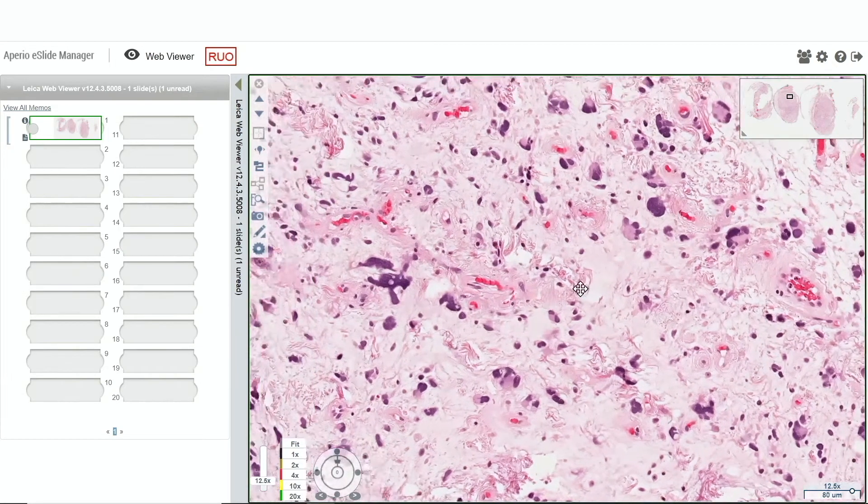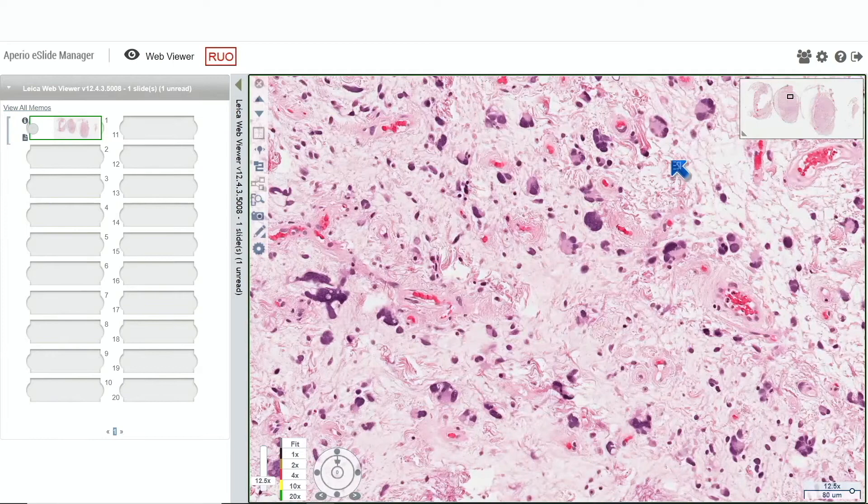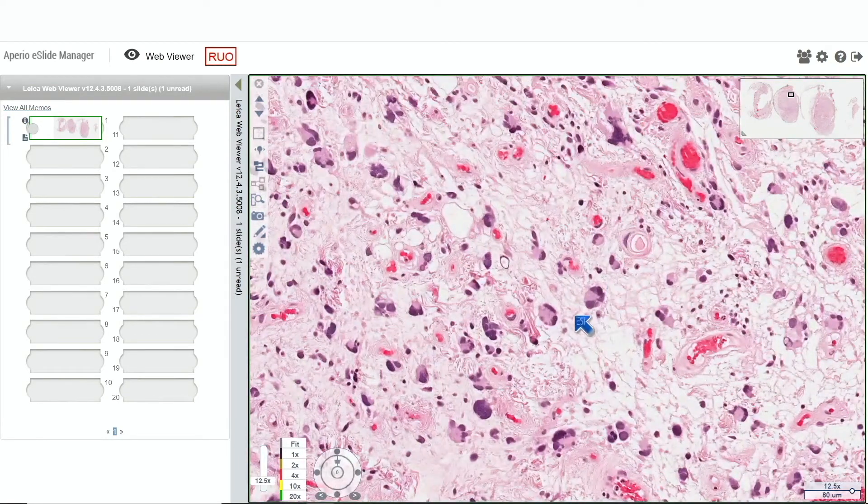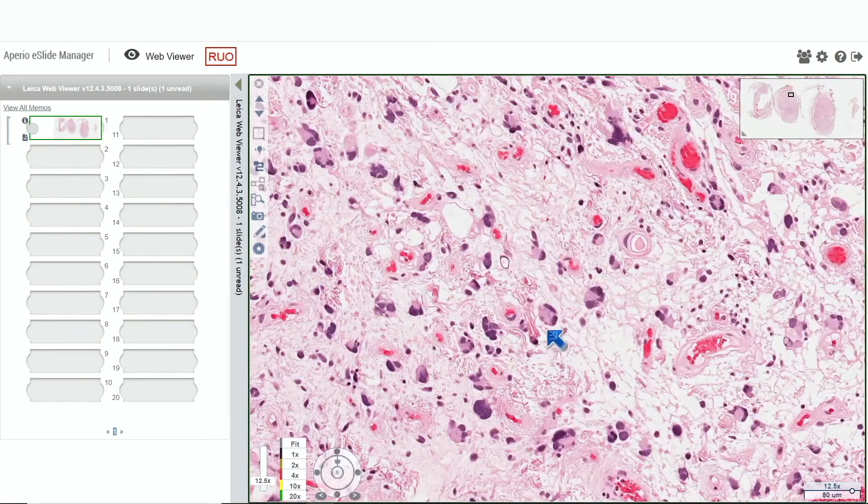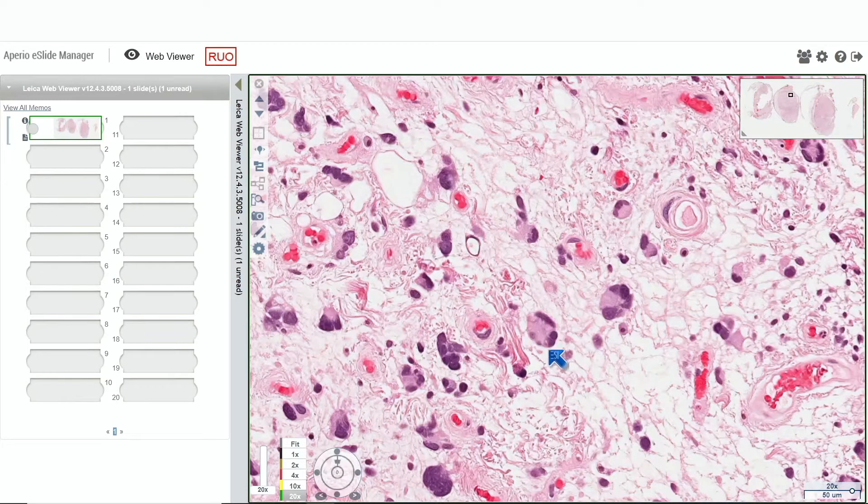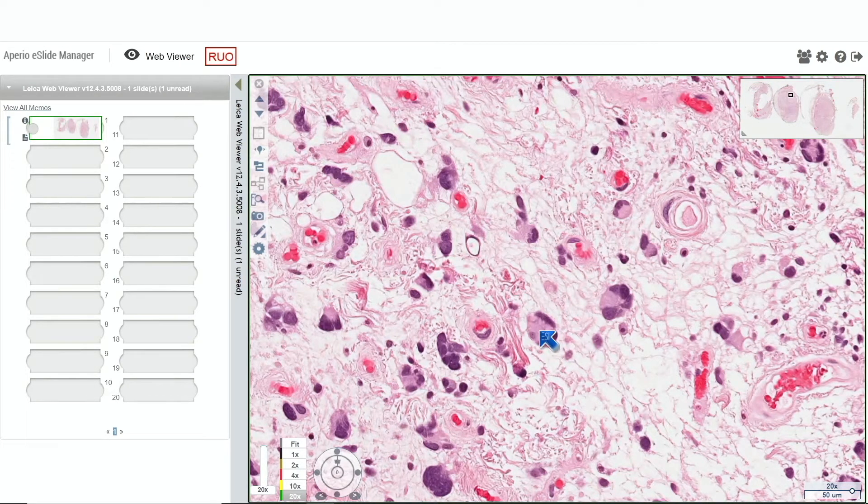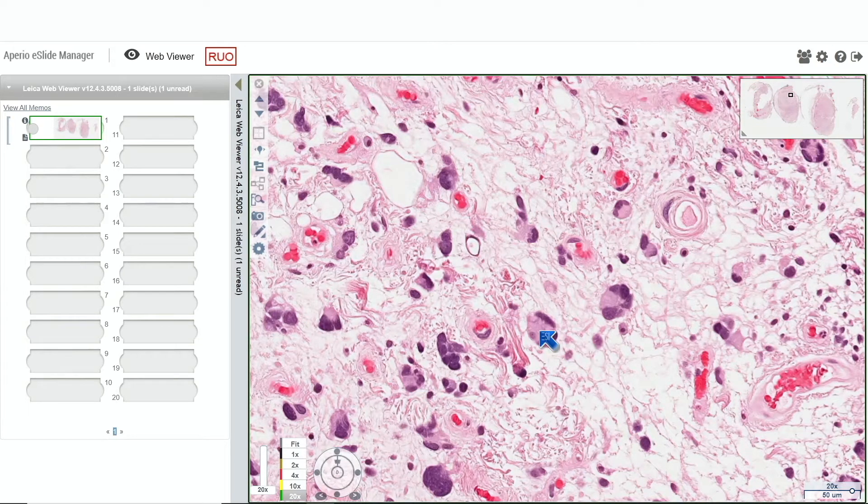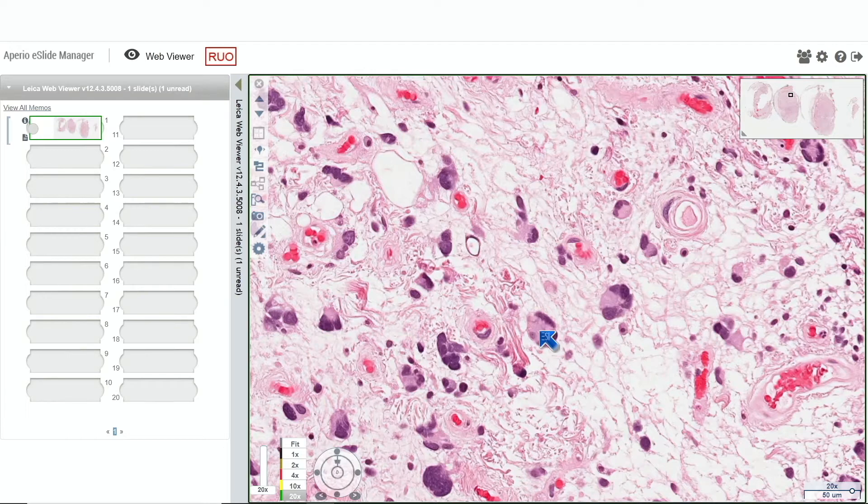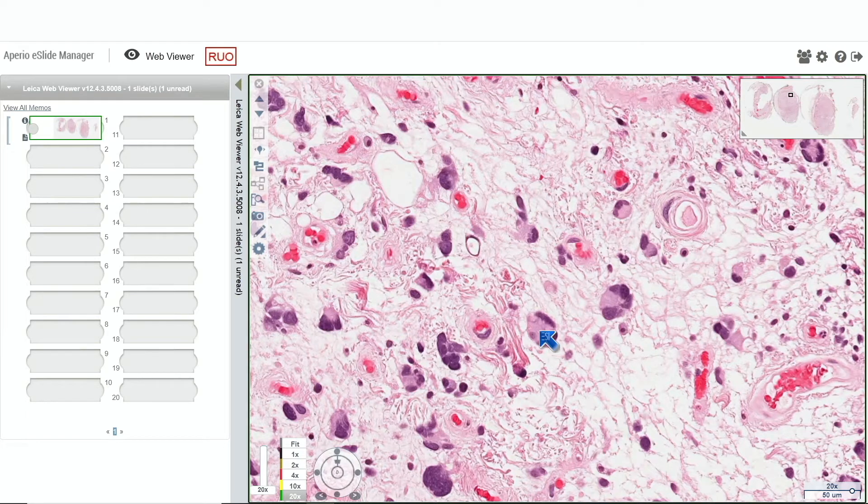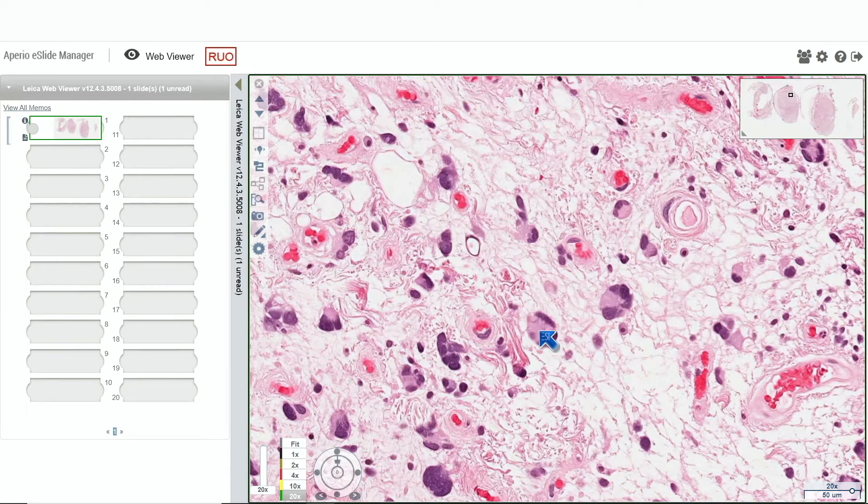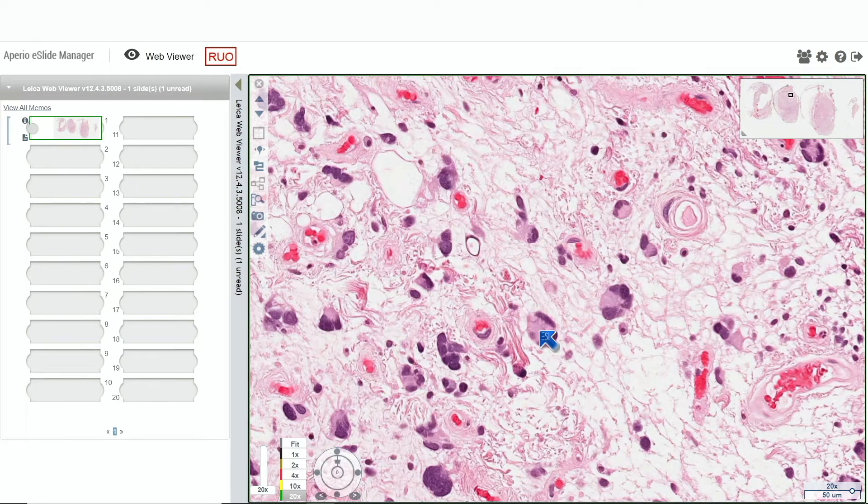Look at these floret-like giant cells. Let's talk about those, with this eccentric ring of nuclei and eosinophilic cytoplasm. When I hear the word pleomorphic lipoma, I always think of these multi-nucleated floret-like giant cells. The point I want to make is although they're very characteristic, they're not pathognomonic because you can see these floret-like giant cells in lots of different things, including well-differentiated liposarcoma. Just because you see these cells doesn't mean it's necessarily a pleomorphic lipoma, but it's pretty characteristic.